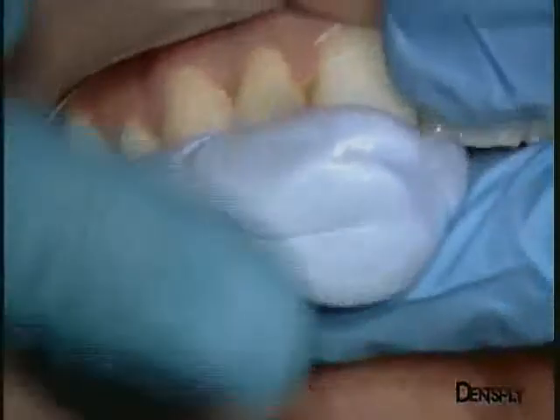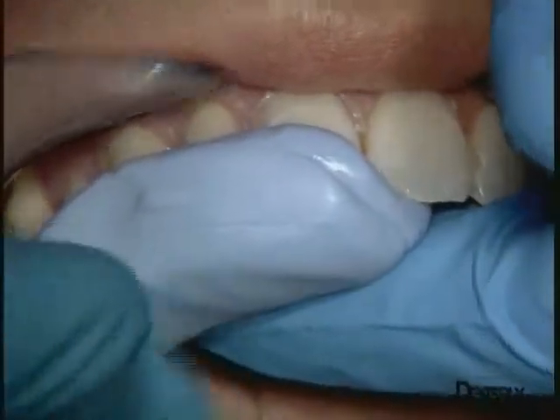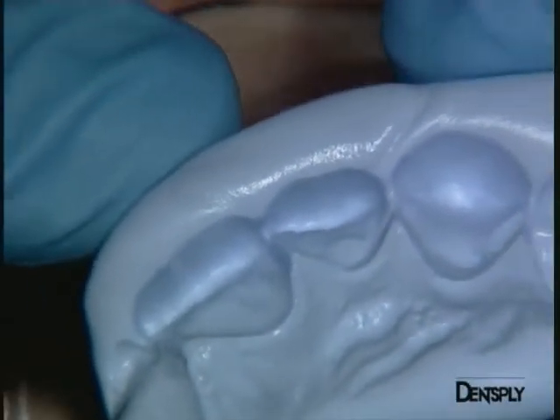The next step is to make the silicone key. In this case, it can be made directly in the mouth, as the anatomy of the lingual face of this lateral incisor is correct. Here is the key — only the lingual part will be retained to form the wall.